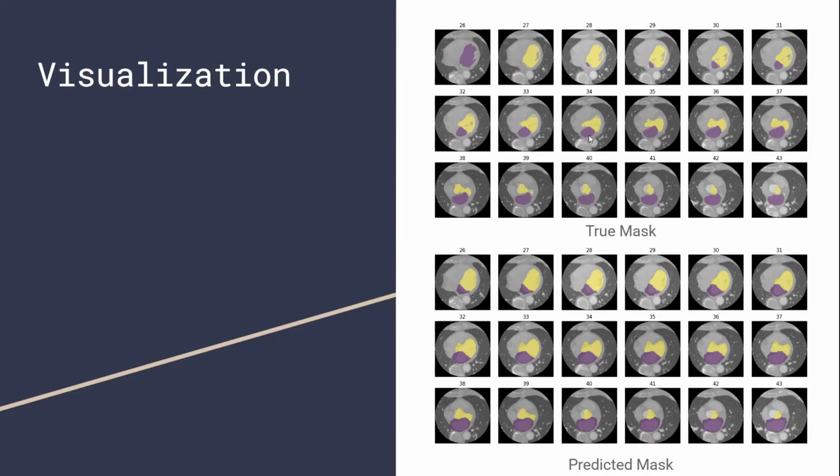I forgot to say label one is one color and label two is another color. So when the picture has only one label, for example left ventricle, it just assigned the default color. I see, so that's a bug when you only have one label. Got it. So I think it captured the structure pretty well. Yeah, it's not bad.